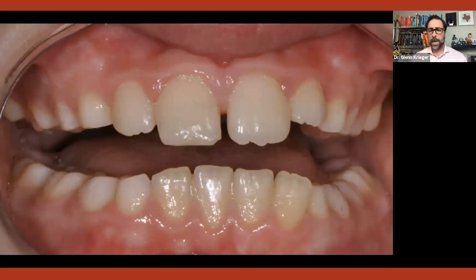Again, nothing jumps out to you here. He doesn't look crazy. This is a classic 8-year-old boy that I see in my practice. But look at the lower molars. Look at the way they're tipped in a little bit towards the lingual side. Look how the tongue almost rolls over the teeth a little bit. These are warning signs that anybody learning about airway starts to look for.